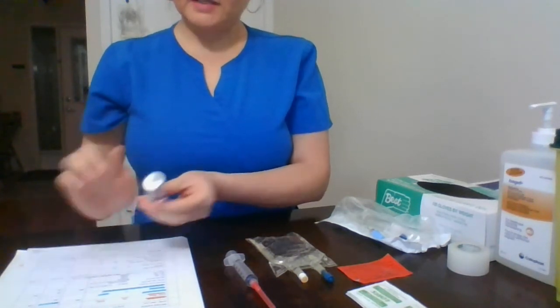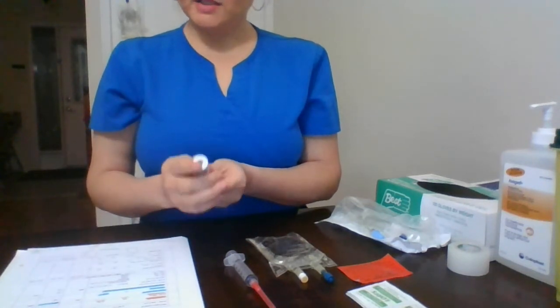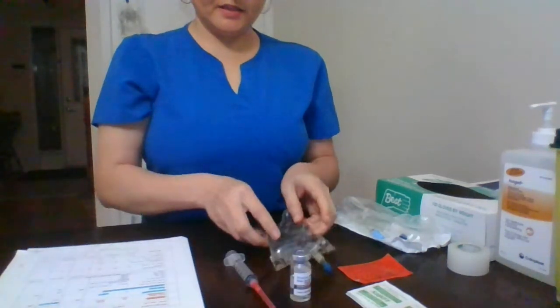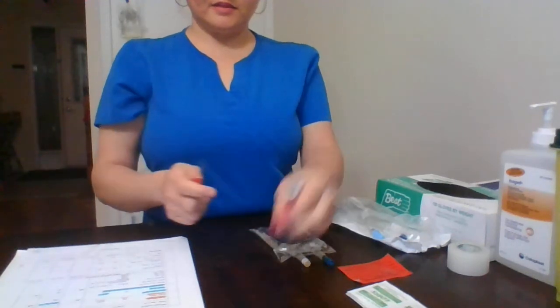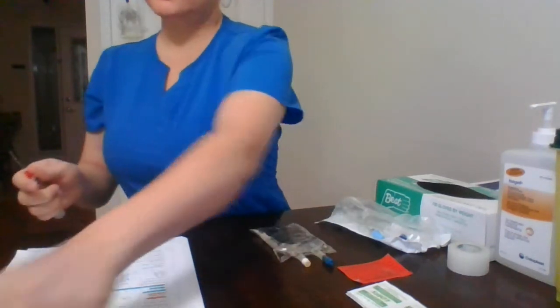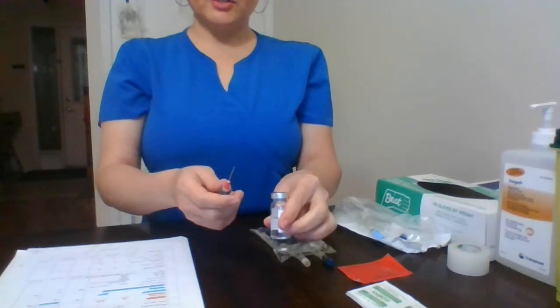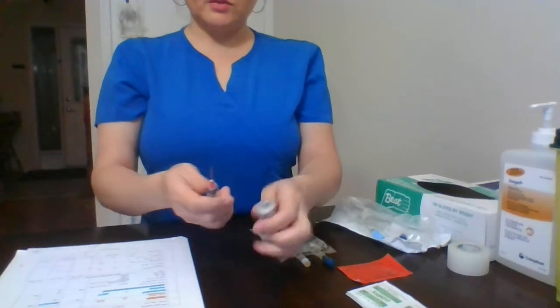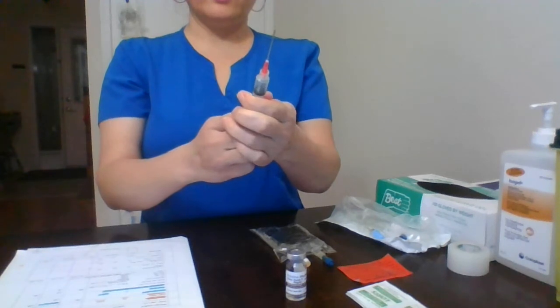And the time we need to infuse this medication is 8 a.m. Now I will go ahead and reconstitute. We will go ahead and take the medication in our syringe and add it into our mini IV bag. So I will take 3 ml of air.